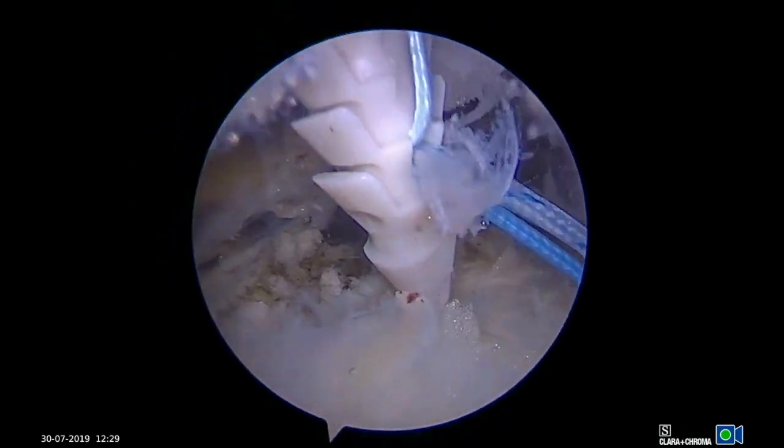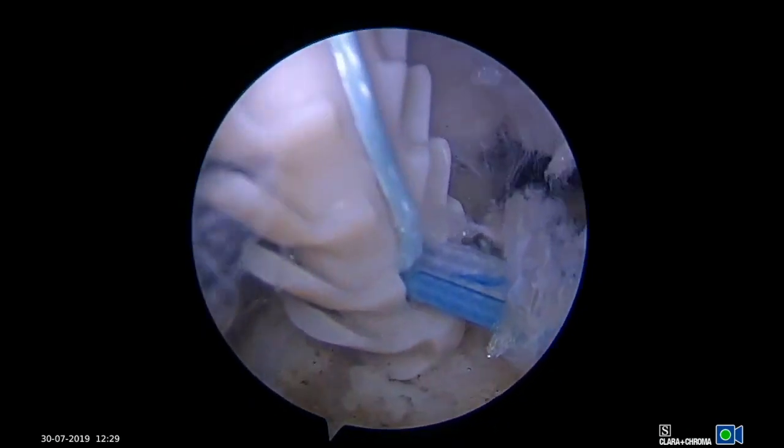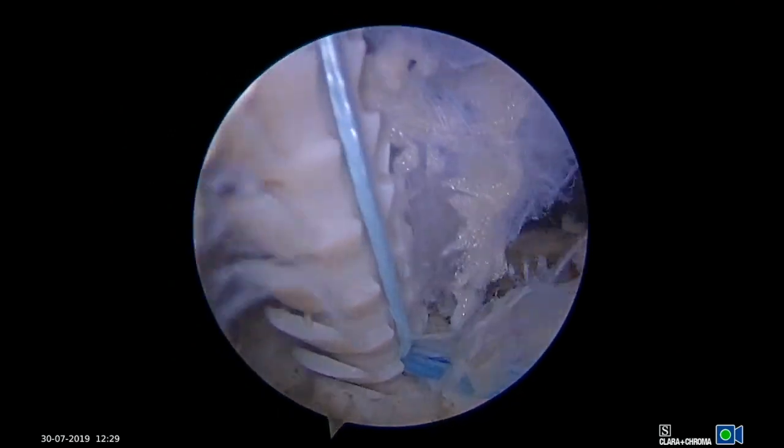Next, one limb from each knot stack is grasped and placed into a knotless lateral row anchor, which is inserted through the lateral portal. The sutures are tensioned, the anchor is secured, and the remaining sutures are cut.